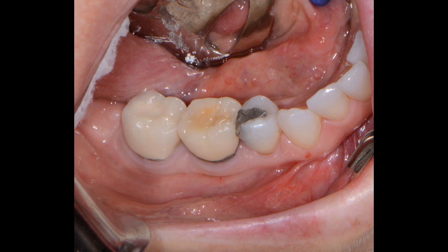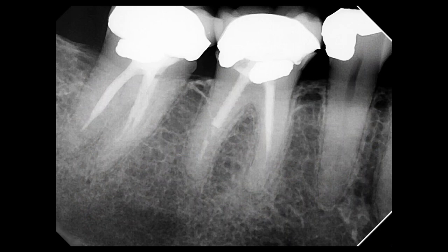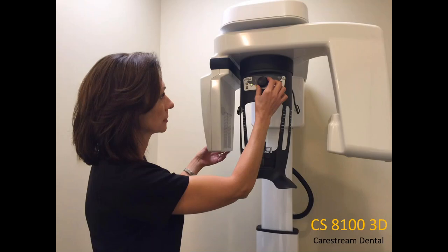Real quickly, we identified teeth number 30 and 31 as having crown restorations. So the first thing we're going to look at is not the most ideal endo that we would prefer in a patient. We know there are restorations right at the cervical portion of these crown restorations. So there must have been some recurrent decay that the previous dentist tried to correct by placing cervical amalgam restorations.